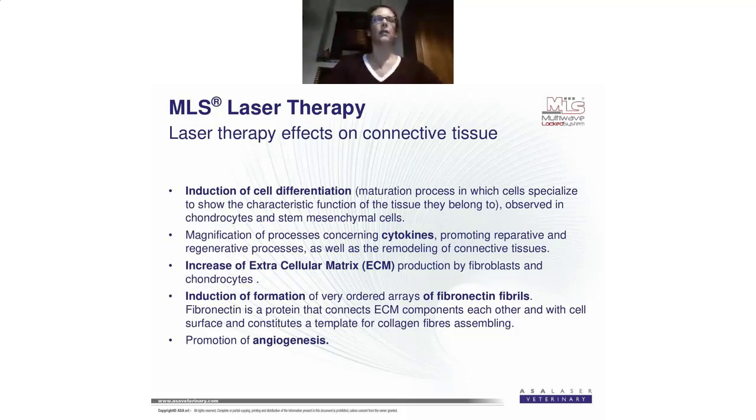This is due particularly to the photomechanical effect of the laser therapy, which is very effective on the interstitial space of the tendons and on the matrix. So we increase the extracellular matrix production by fibroblasts and chondrocytes, but fibroblasts in this case.